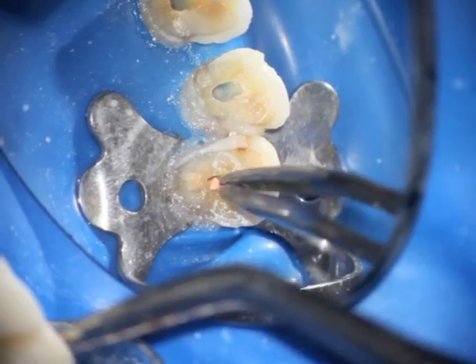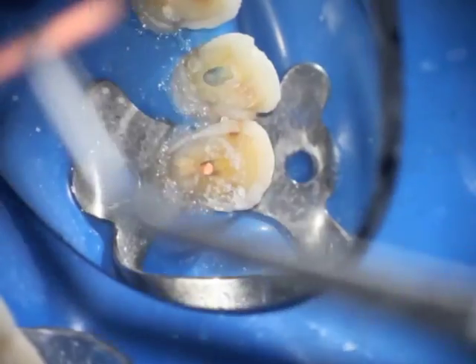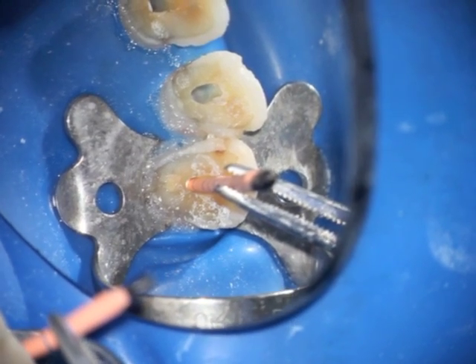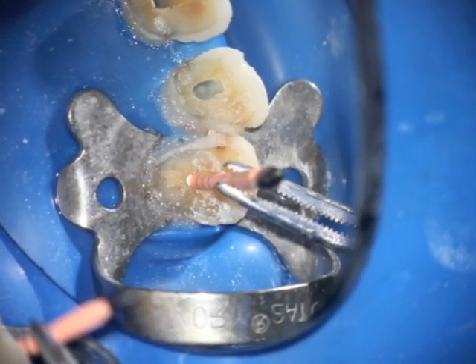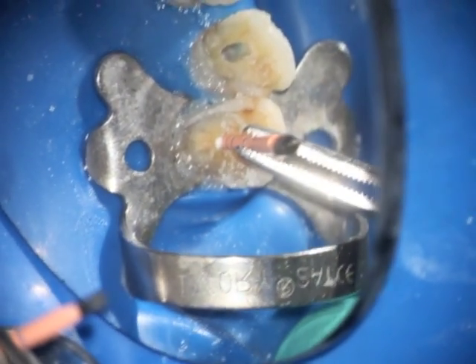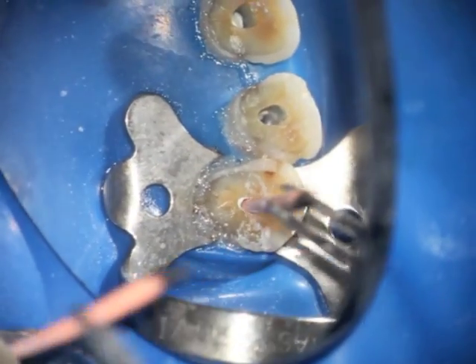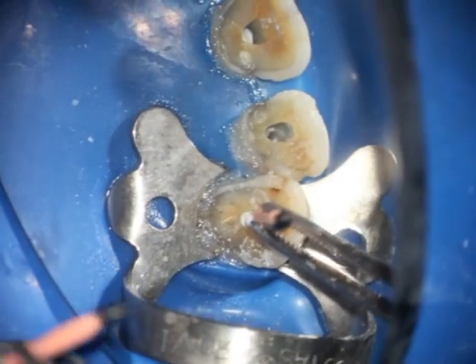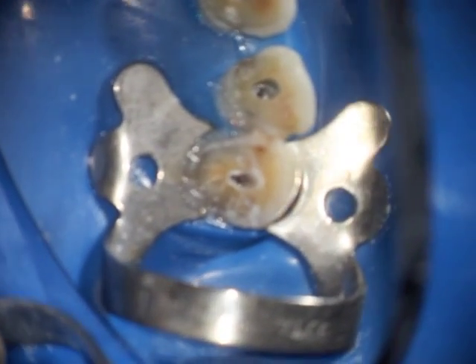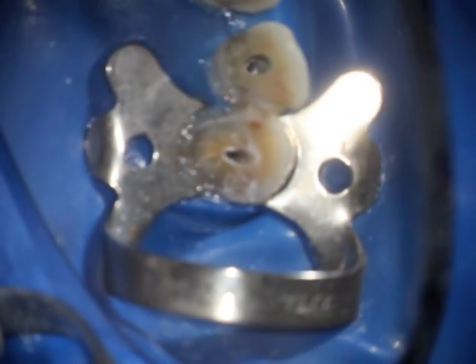The tips are actually cut off using a sharp scalpel, and the tips are placed in the canal. The remaining portion of the gutta-percha cone is used to insert and condense that cut tip down in the canal. This creates an immediate post space that is left once the segment of gutta-percha beyond the post has already been cemented.